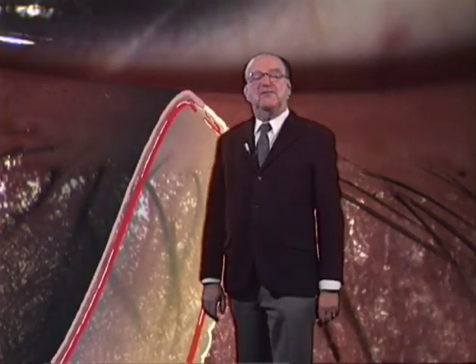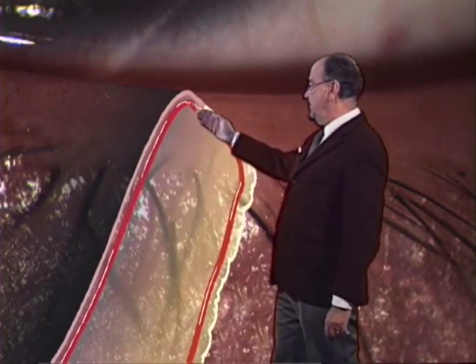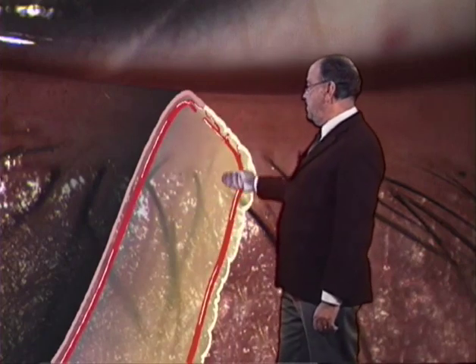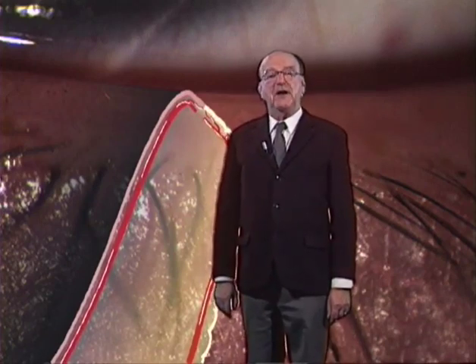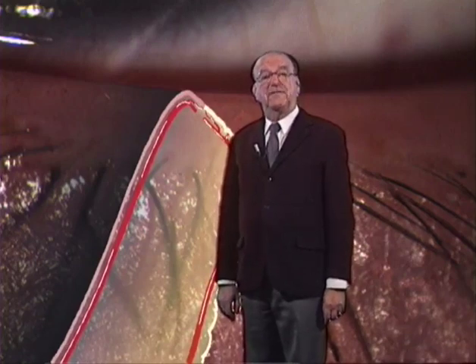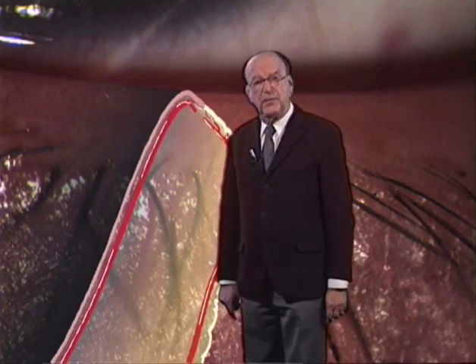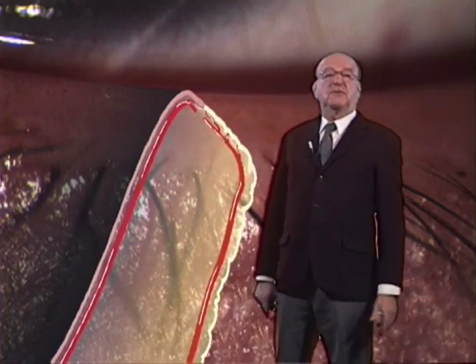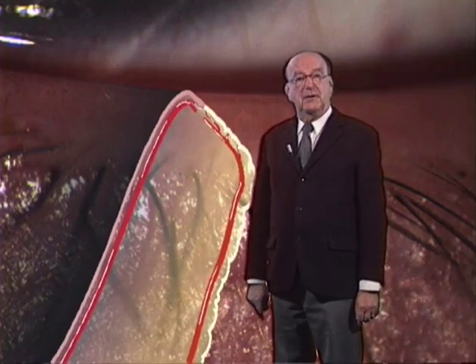A border is found also when we examine the distribution of the vessels in the subepithelial tissue. An abnormal aspect may be related to either an increased visibility of the vessels, which is mostly a sign of atrophy of the skin, or to an inflammatory or circulatory hyperemia, or to a combination of both.